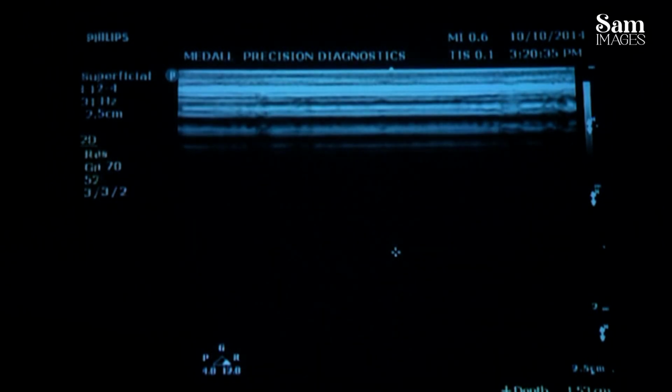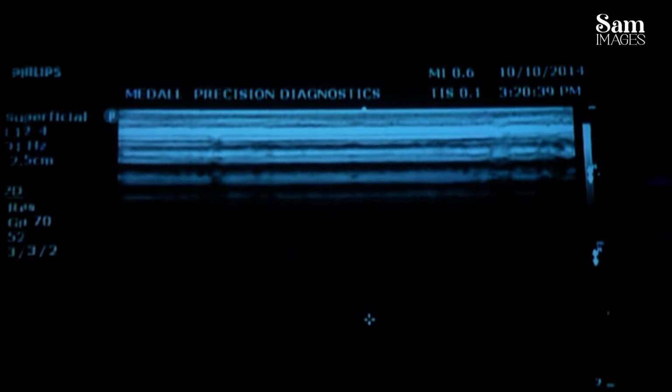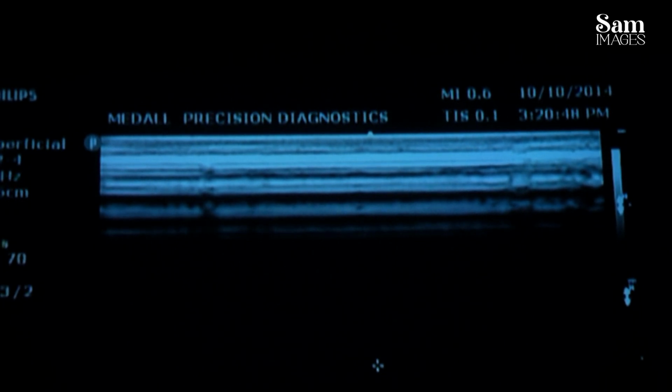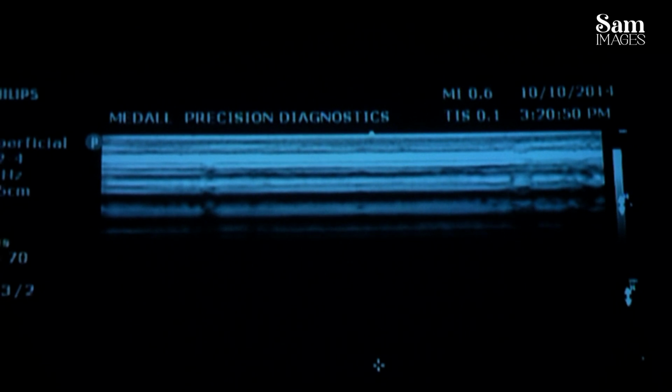So that way, with dynamic actions, you can demonstrate the subluxation or dislocation of the temporomandibular joint. Still, for subtle changes of the articular disc, if you want to study it, you better go for an MRI. MRI will be the best. This is a screening modality only.